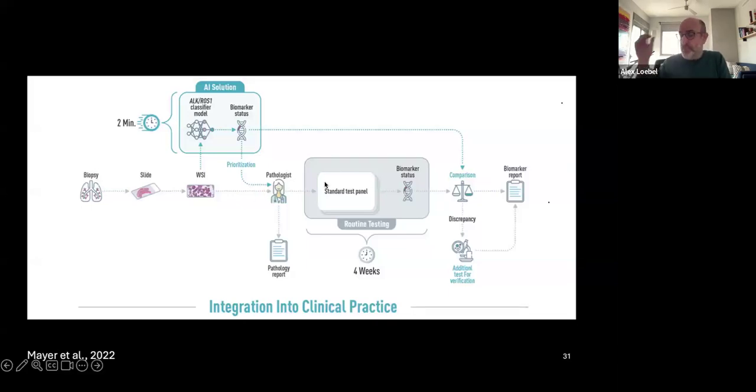And from our experience at Sheba, so we know. So we usually do this workflow for patients that require answers very fast. 1/3 of the patients would not survive the 4 weeks period.